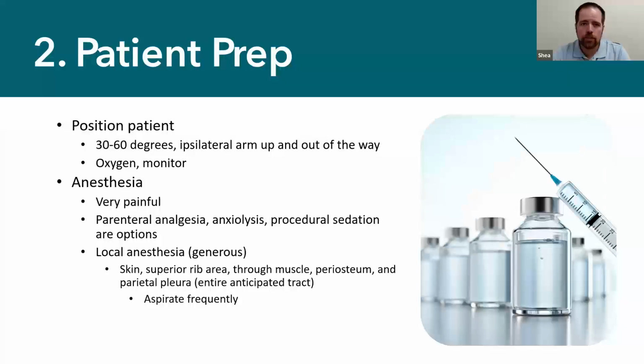If you've never had one of these placed or you haven't placed one in a long time, they are extremely painful. We're cutting through a lot of tissue. There's a lot of nerve endings in there. These are very, very painful in your awake patient. Obviously, in your cardiac arrest, that's a very different circumstance. But assume that they're going to feel it, even if they're a little bit confused. Using a lot of local anesthesia is going to be really key for this.